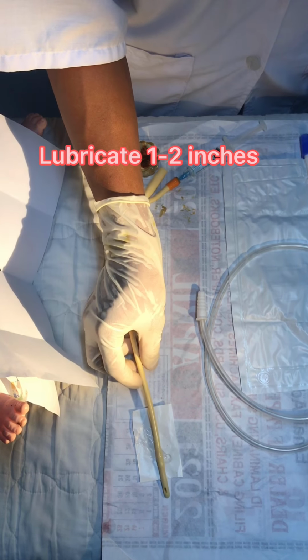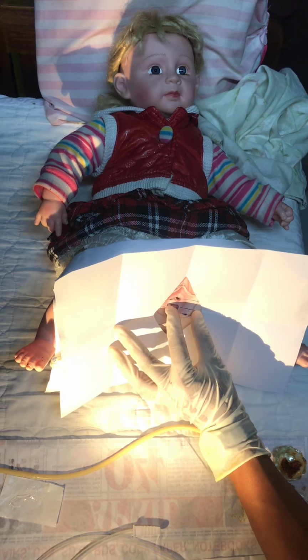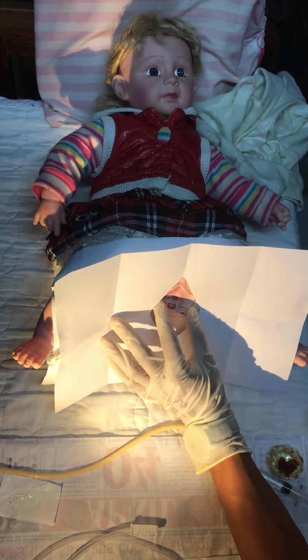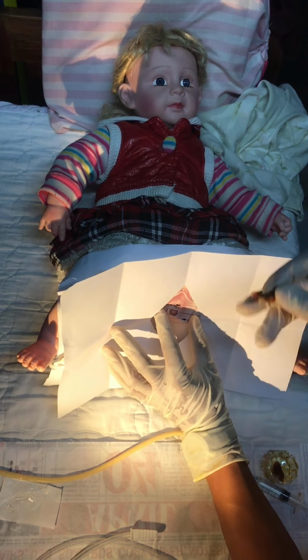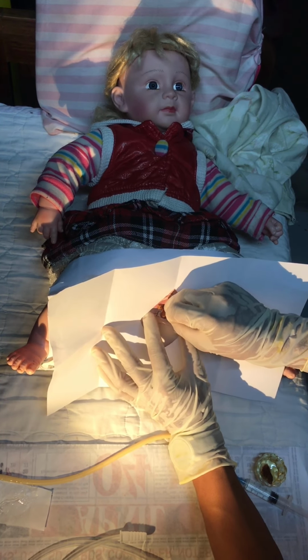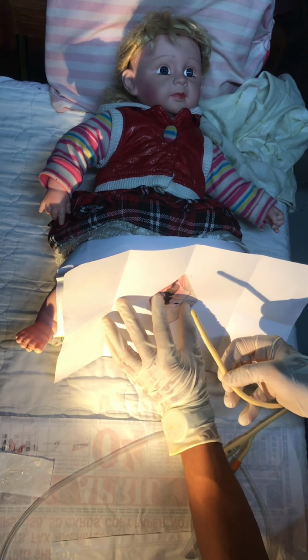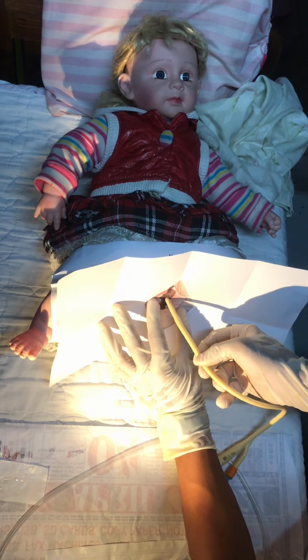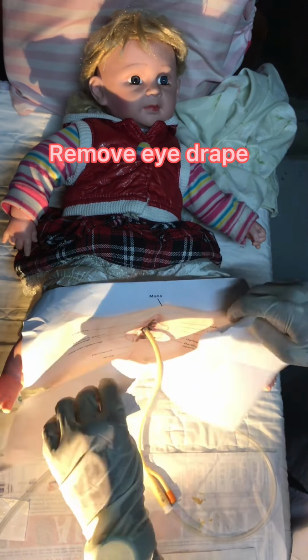Lubricate 1 to 2 inches of the catheter tip. With the thumb and forefinger of your non-dominant hand, spread the labia and identify the urinary meatus, and maintain the hold until the catheter has been inserted. With the dominant hand, disinfect the urinary meatus using cotton balls with betadine. Insert the tip of the catheter into the dimple-like structure below the clitoris. Then remove the fenestrated drape.